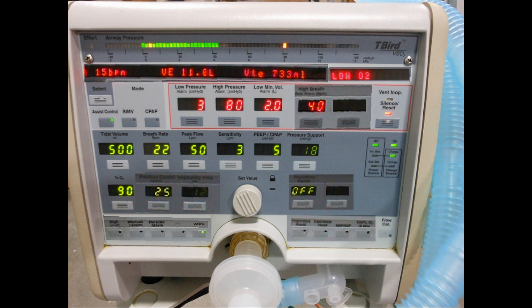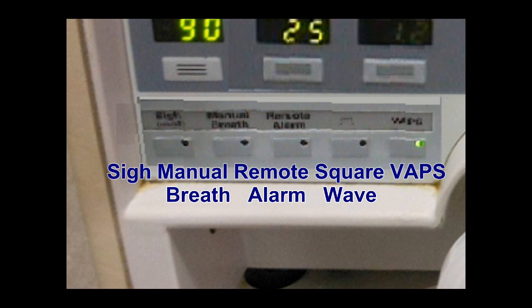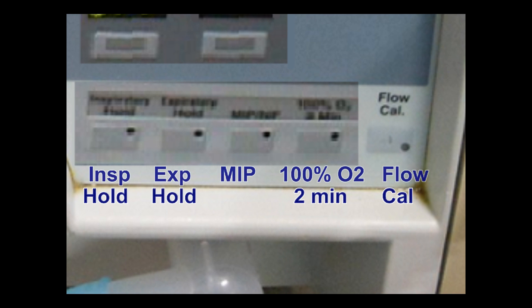The bottom row of controls includes a sigh breath control, a manual breath control, a remote alarm switch, as well as square wave and VAPS ventilation. On the right side of this bottom row you can see the button for inspiratory hold, expiratory hold, a button to measure MIP, 100% oxygen, and the flow calibration button.